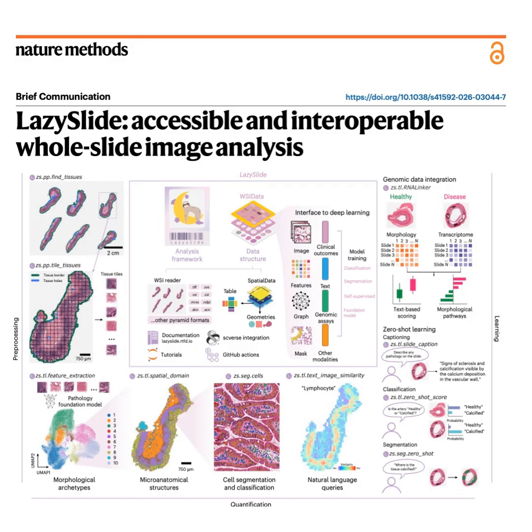That is mind-blowing. And the paper actually demonstrates this with an amazing case study on organ classification. Oh, this part is fantastic. Yeah. The researchers took whole slide images from 9 distinct human organs, brain, lung, liver, stomach, all sorts of things. And the foundation model had never been specifically trained to classify this data set. Zero specific training. Right. So the researchers just queried the system with a simple text prompt, which organ is this? And using that zero-shot cosine similarity with just a single line of code, the model correctly classified almost all of them.